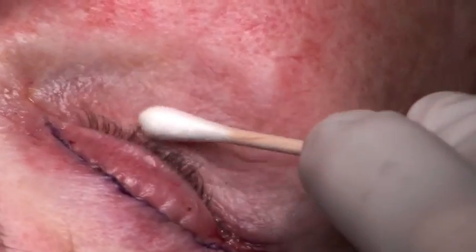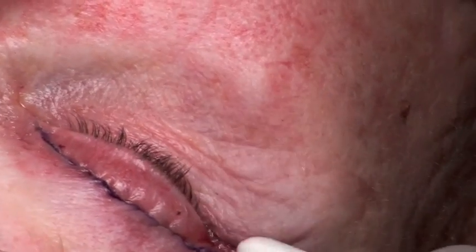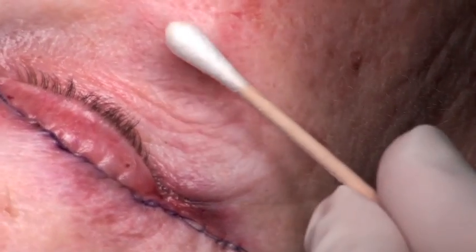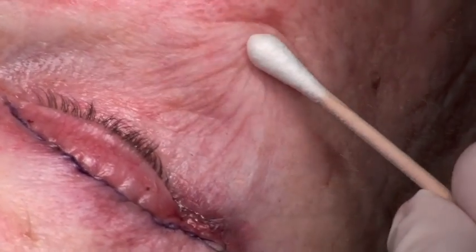At this point, the patient had just undergone upper lid blepharoplasty, lower lid blepharoplasty, and ectropion repair bilaterally. What I'm now showing is the looseness of the skin and festoons that we're going to be tightening with the laser shortly. And actually also right in this area.